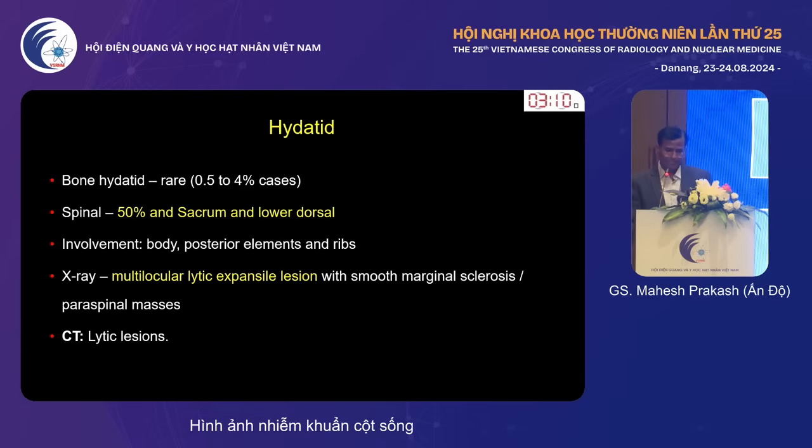Coming to some of the rare cases which you may see in your lifetime, or you may not see, like the hydatid. In my clinical practice of 20 years, I have just seen 3 cases. So it's not very common, but because it has very typical imaging features, if you find it, then you can easily appreciate it.